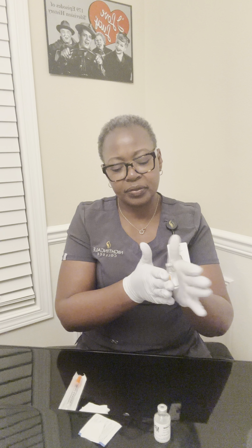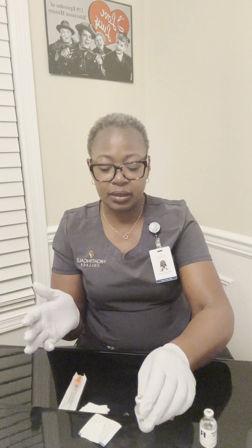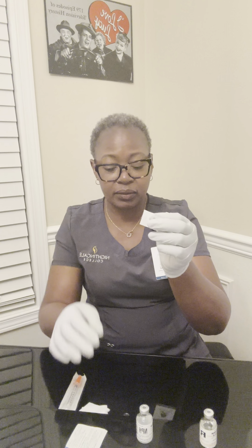I'll go ahead and roll it on my palms for consistency, and then clean the vial with a clean alcohol wipe, being careful not to introduce new germs.